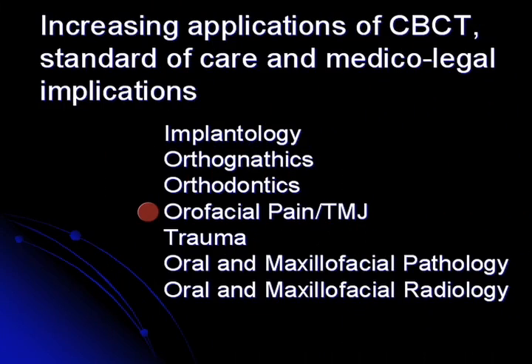Orofacial pain and TMJ, this is becoming standard of care now. Open and closed mouth acquisition of images to examine the joint structure for a lot of degenerative joint diseases and orofacial pain related to TMD or temporomandibular disorders. Evaluation of trauma, very profound utility there. And then obviously in oral maxillofacial pathology and oral maxillofacial radiology.